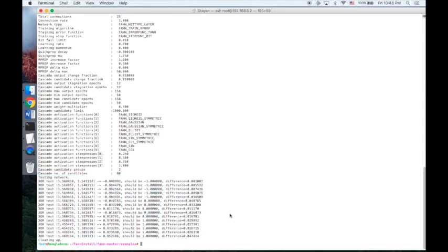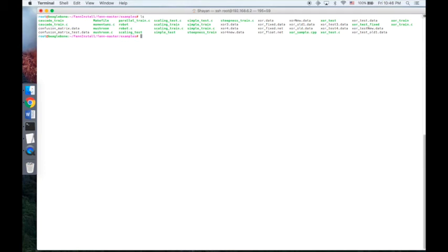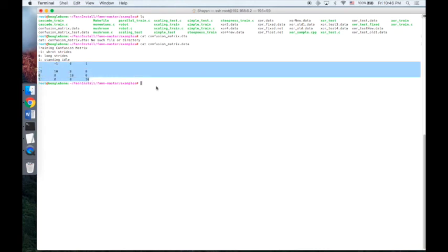After the testing and training of the system, we drew up confusion matrices for both the training and the testing. Because the training and the testing were completely successful in each trial, that resulted in perfect confusion matrices. Now this is the confusion matrix for the training. We had 10 trials of training for each type of motion, and here, as you can see, we have a perfect confusion matrix for training of the system.